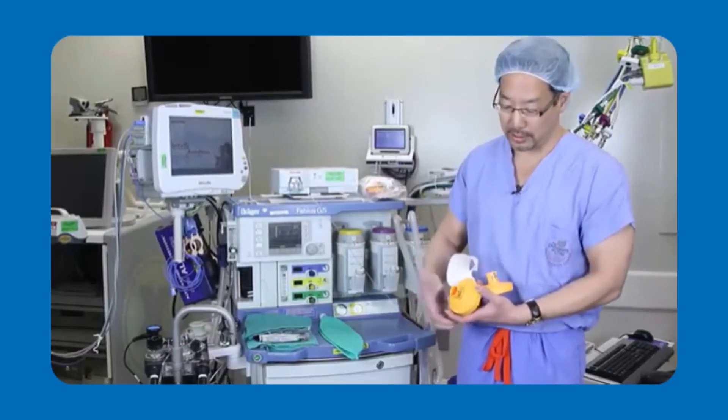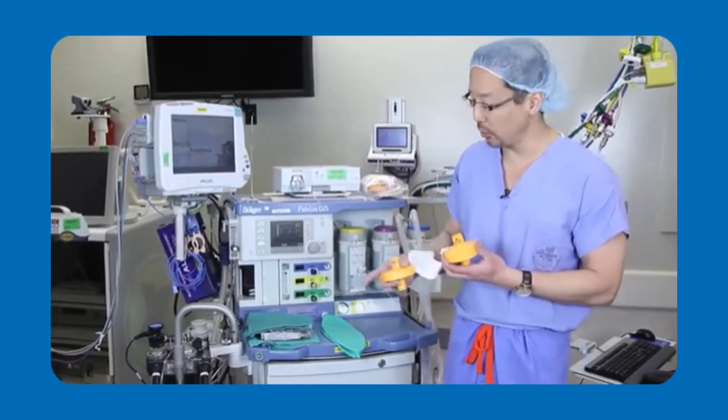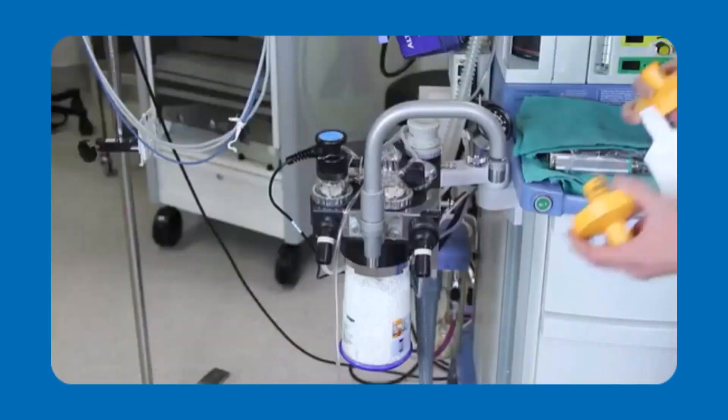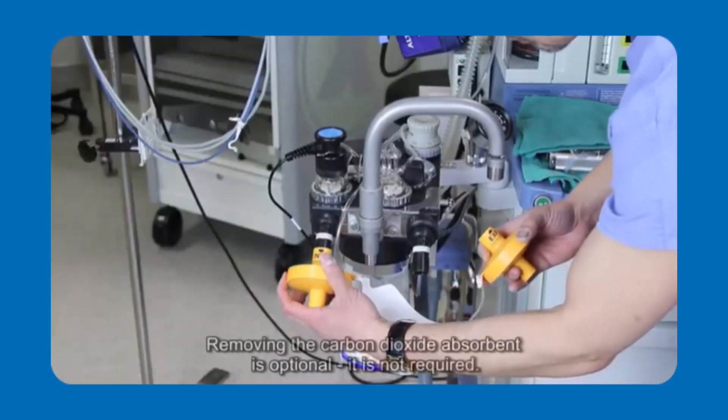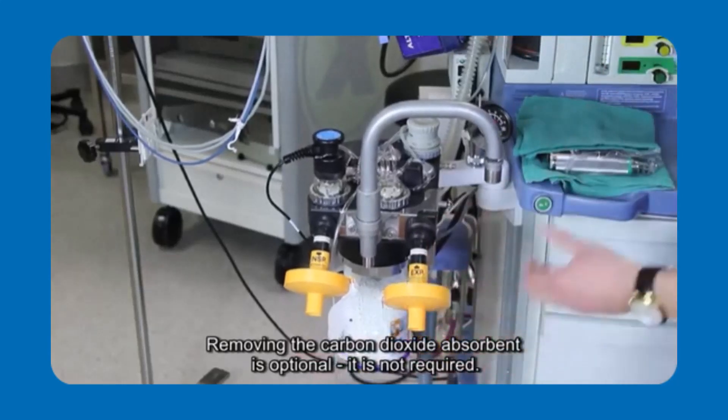It's important to realize that on these filters there's an inspiratory filter and an expiratory filter. These correspond to the inspiratory and expiratory limbs of your anesthesia machine. I'll be placing the inspiratory one on the inspiratory side and the expiratory one on the expiratory side.